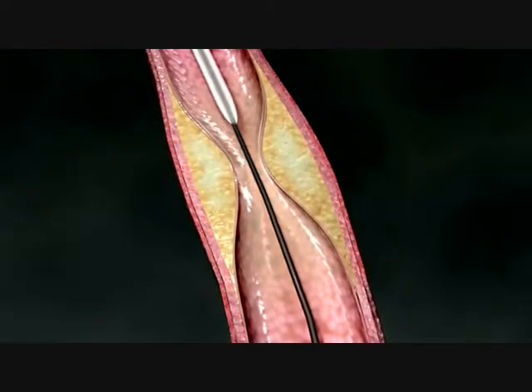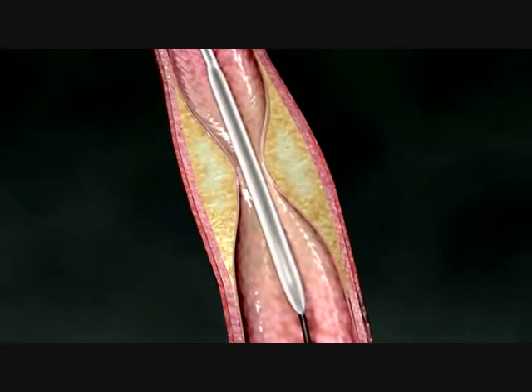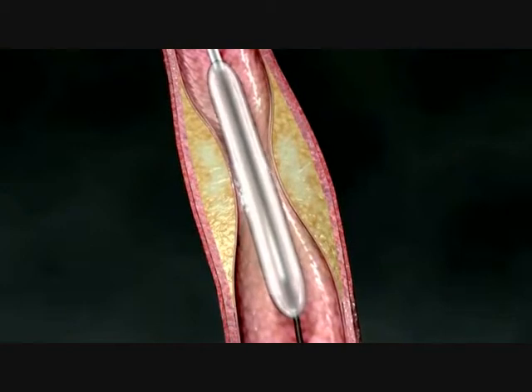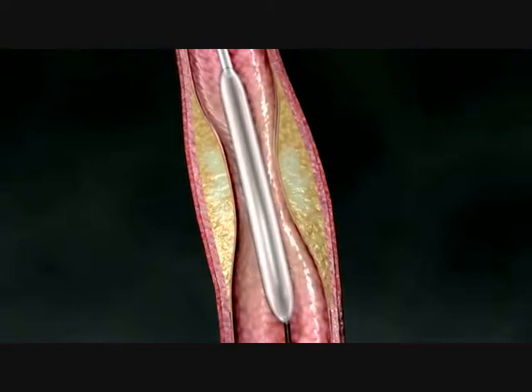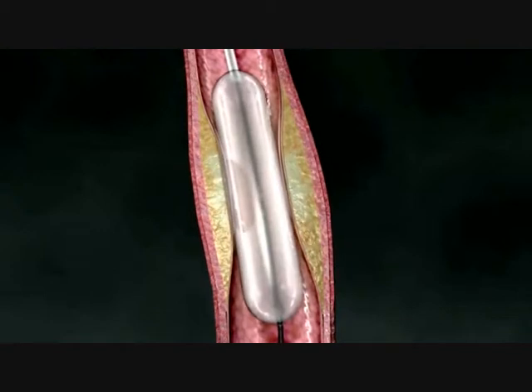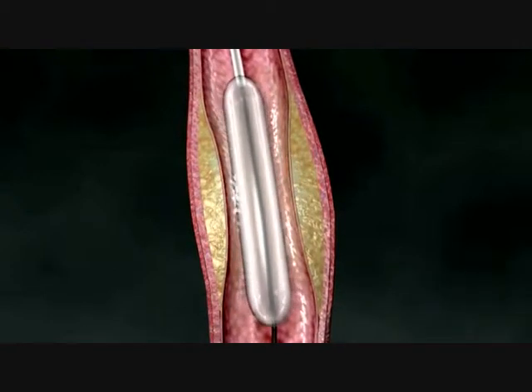After the location of the blockage is identified, the catheter, with a small balloon at the tip, is then reinserted near the blockage or the narrowing in the arterial wall. When the catheter reaches the blockage, the balloon is inflated, pushing the artery open and widening the blood vessel enough to increase the flow of blood and nutrients to the heart.